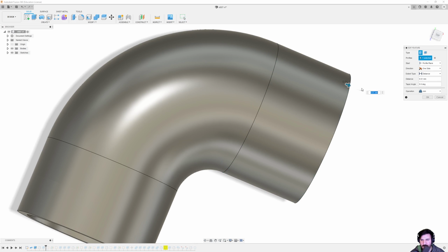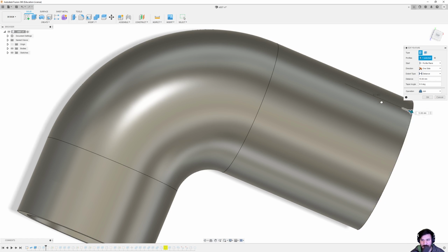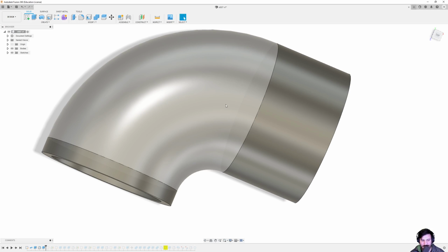So if I do edit, I have a positive extrusion, but it turned out that I didn't need that by the same amount that I had previously positively extruded. So I went back to 0, and it ended up being exactly where it was. That was the issue. This negative extrude just shortened the length of the top.